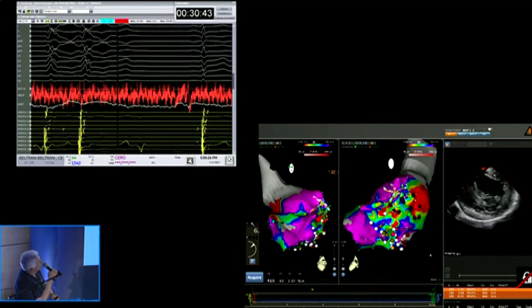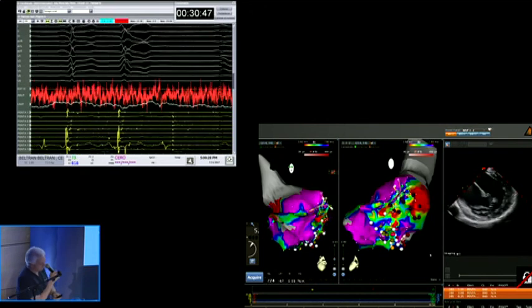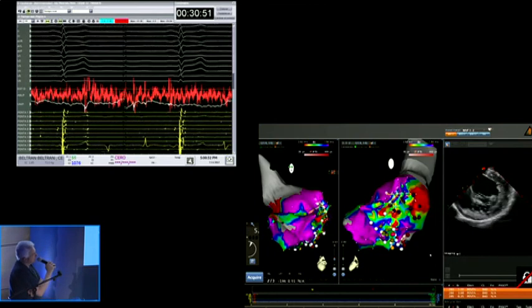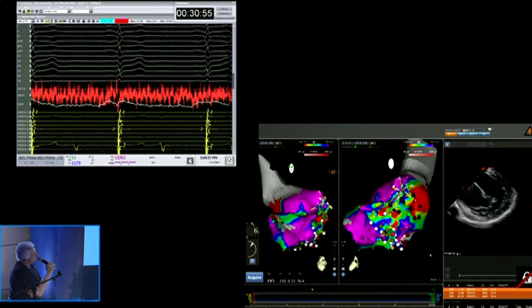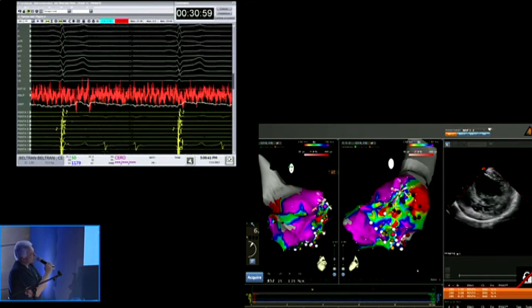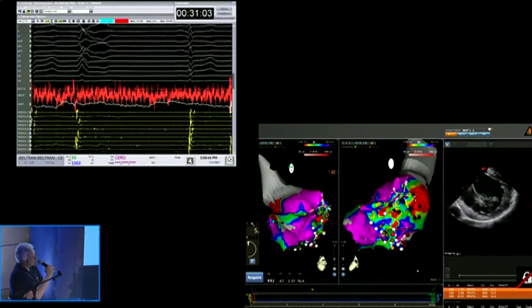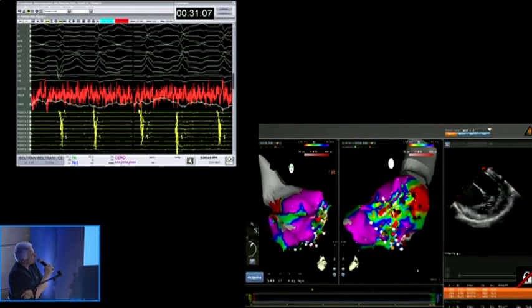So Andrea, the patient presented with PVCs. Would you support doing an aggressive homogenization of this? I would. I'm a bit ambivalent about that. I would, because beyond the recordings being clearly abnormal, you have the support of the MRI. So you know that this patient has a large scar.